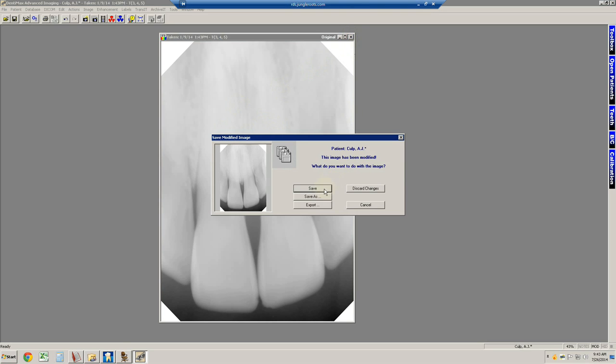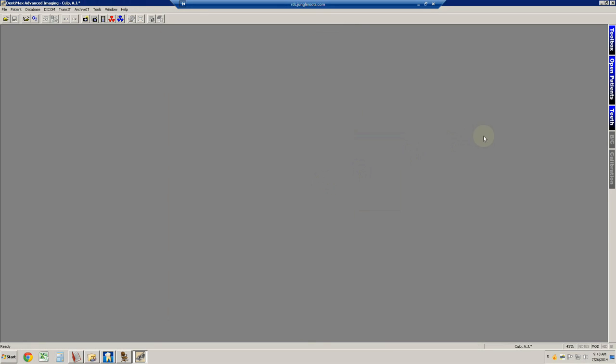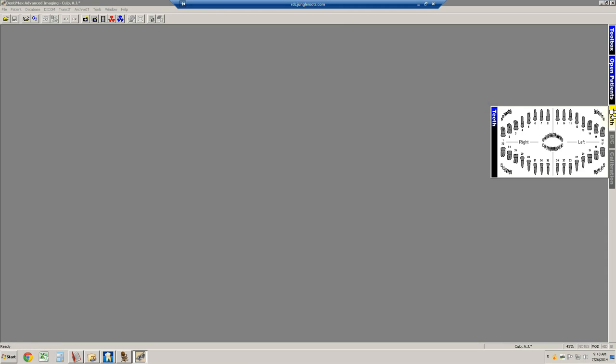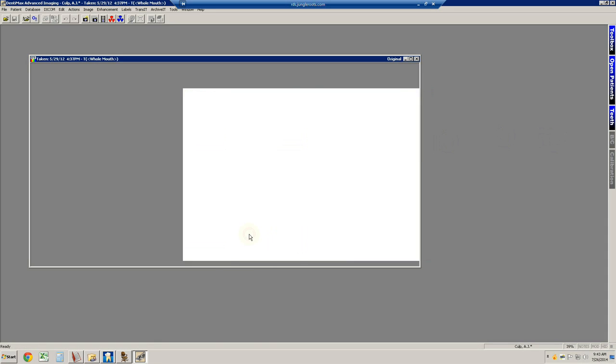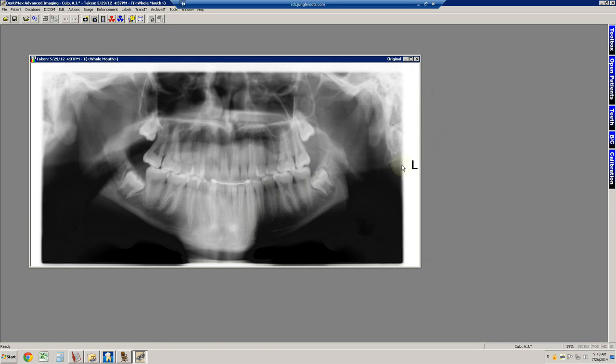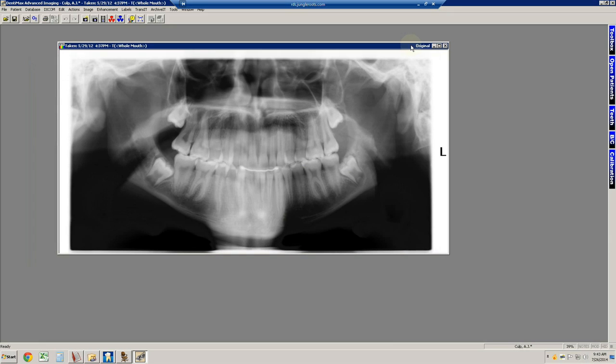If we want additional images to be brought up, we go over here to the tooth button, and when the icon changes from a regular cursor to this cursor, you hit select. The dark teeth all the way around indicate that there's images of teeth entirely all the way through. You select the center because you want all of the different images. In this case, we're going to take a panoramic X-ray. Double-clicking will open it up. In this panoramic X-ray, we would like to send to Dr. Edmonds for evaluation of extraction of these wisdom teeth.